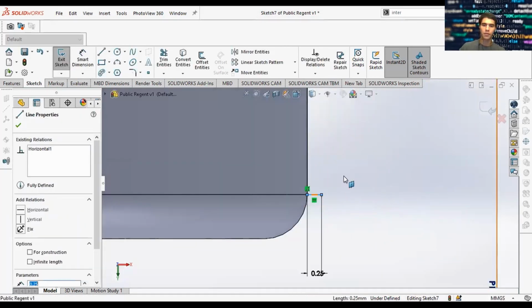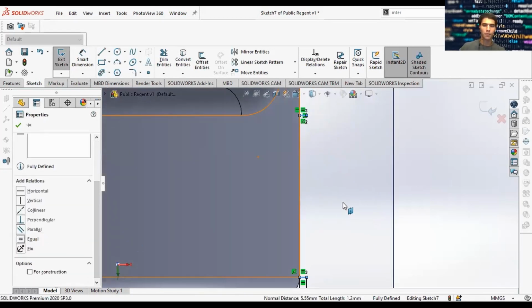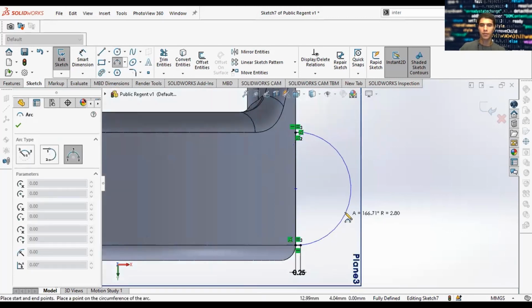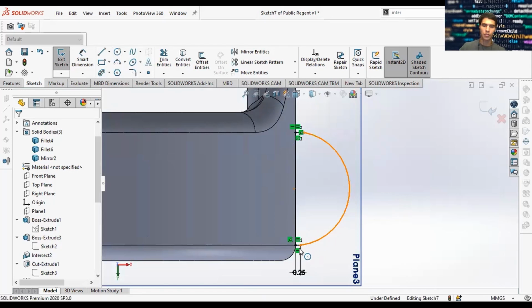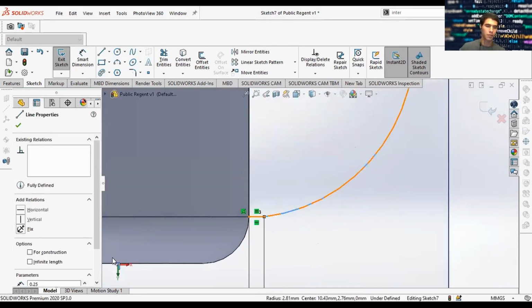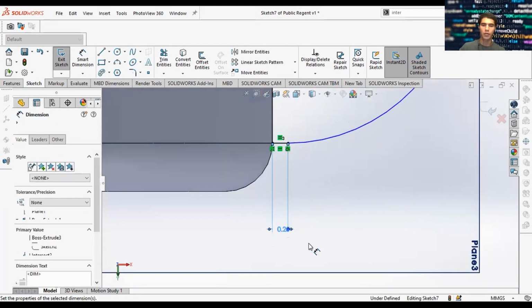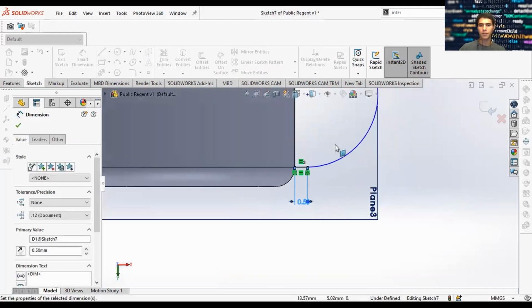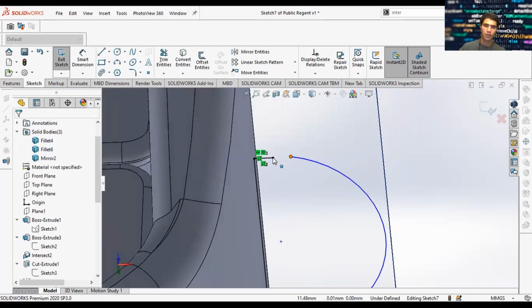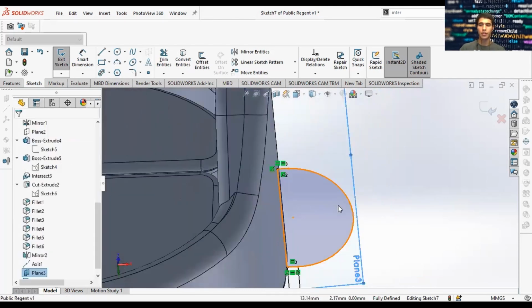Set this line equal to this line, so we don't have to measure it again. And then add an arc, a 3-point arc right here, and set the constraints to tangent. So you can have a full tangent 3-point arc. And I'll do even better. How about we make this 0.5 and connect this to this. So now we have a fully closed sketch.